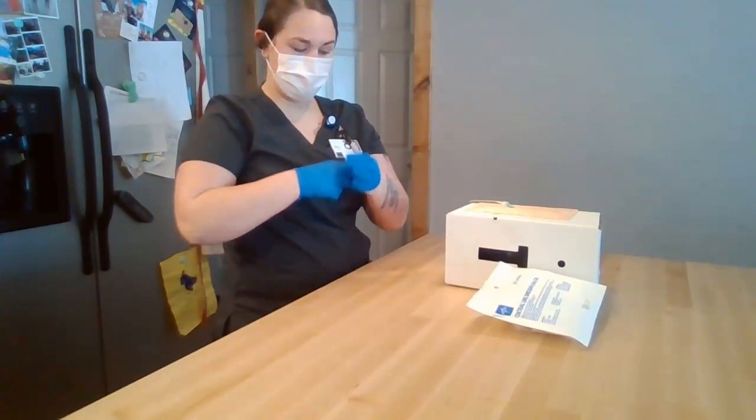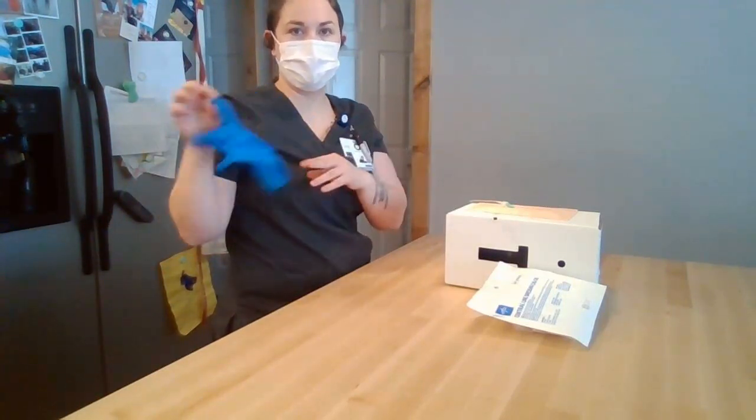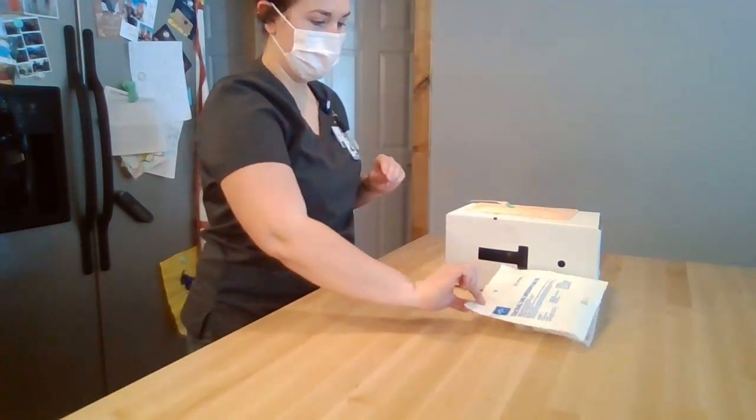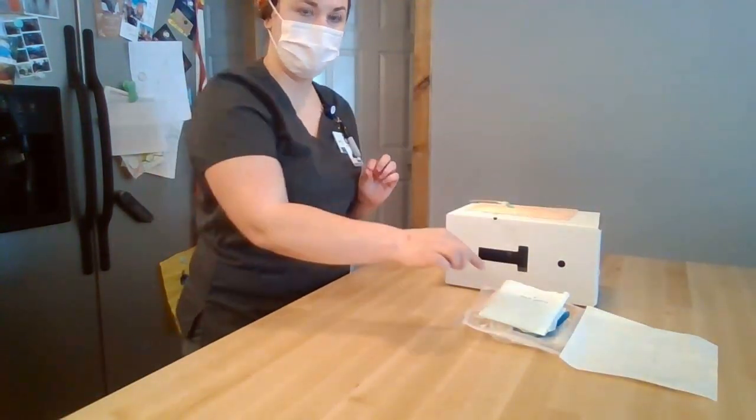Once I've done this, I'm going to remove my gloves and discard them in the trash. I'm then going to perform hand hygiene again. Once I've done this, I'm going to open my skills kit away from me and get out my sterile gloves.